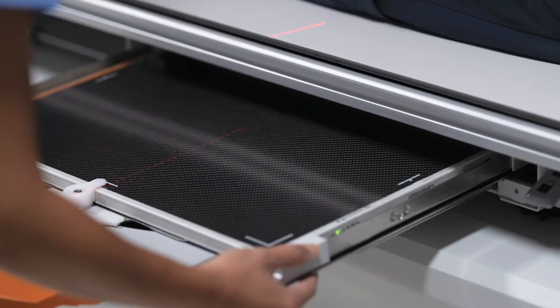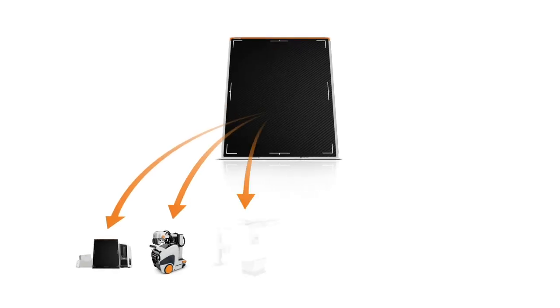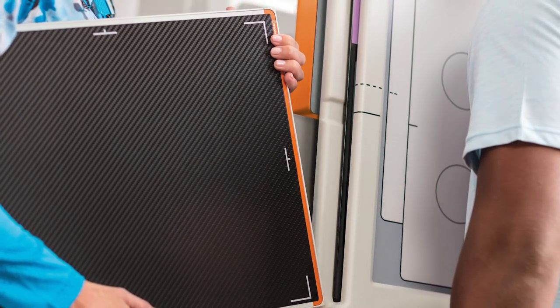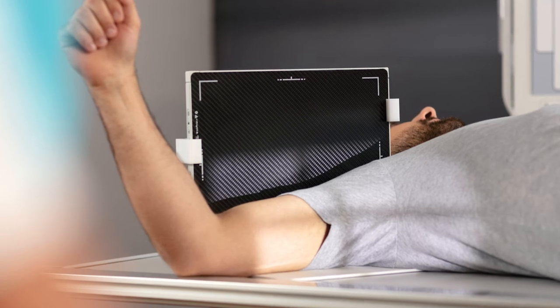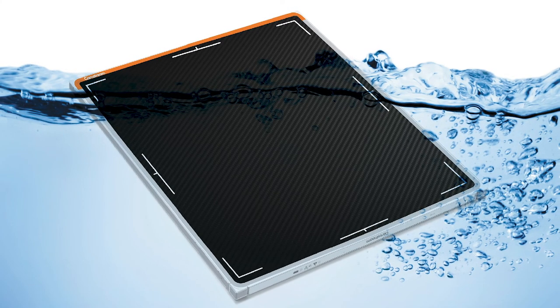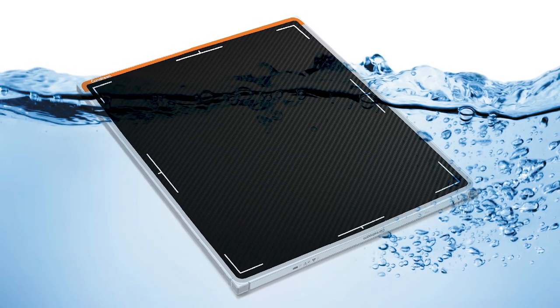Wireless detectors are available for both in-bucky and tabletop exams. Our DRX Plus detectors are wireless and with X-Factor have the ability to be shared with other DRX equipment. We offer a range of sizes and scintillators, so you can simply select which ones are best for your facility. DRX Plus detectors also have an IP57 rating, which provides protection against dust and fluid ingress.